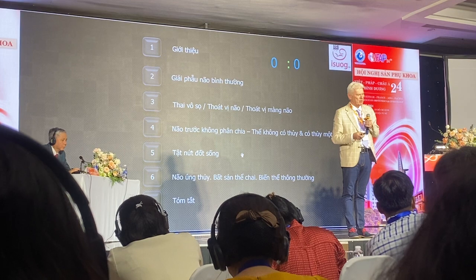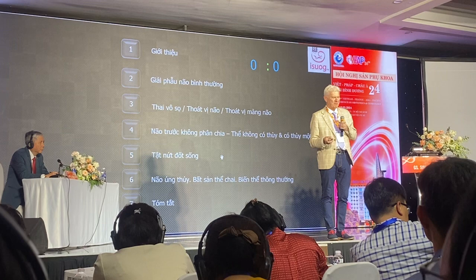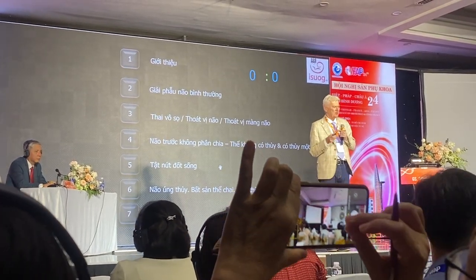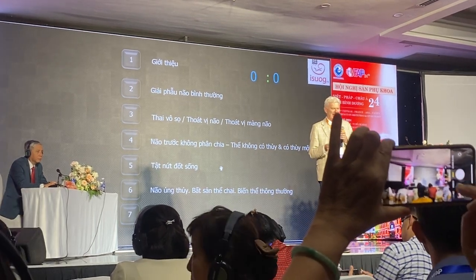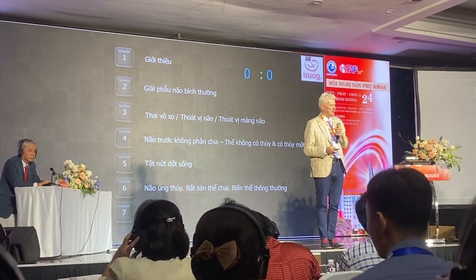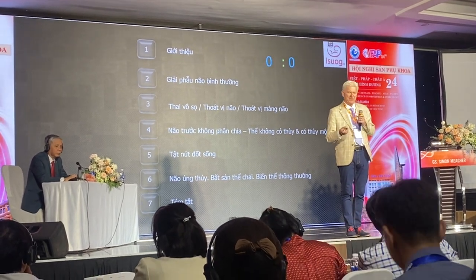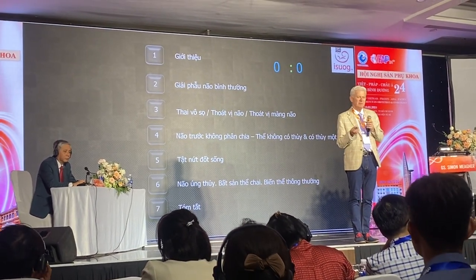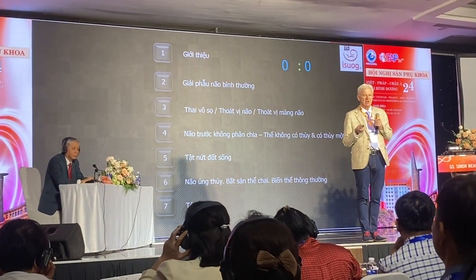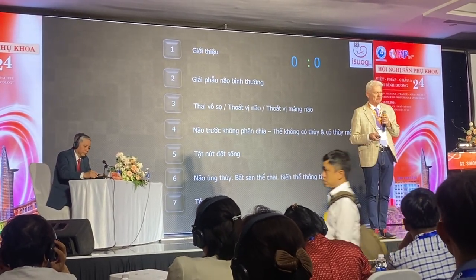And next door, I spoke this morning about exome sequencing. Exome sequencing for fetal malformation is the future. And it becomes so important to make a diagnosis early in the pregnancy and to phenotype the baby, to make sense of the results you get on exome sequencing. So in Vietnam, in 2024, for the next 10 years, you will be focusing on the first trimester scan between 11 to 14 weeks, because you will learn in a sense to realize that what you see at 20 weeks, you can see at 11 to 14 weeks.